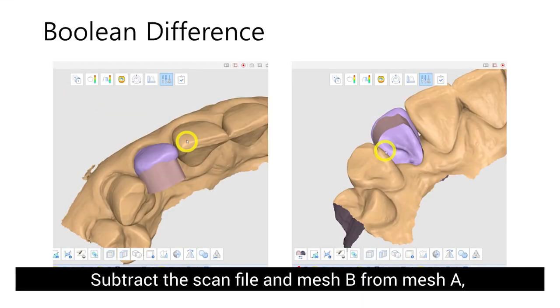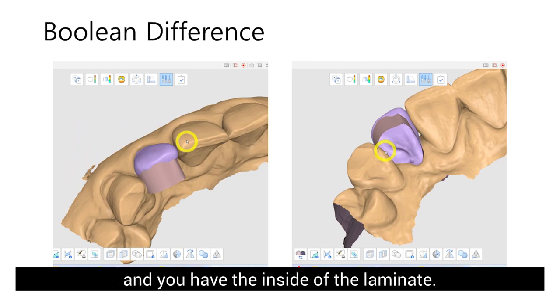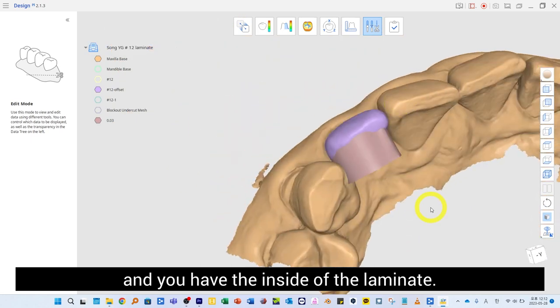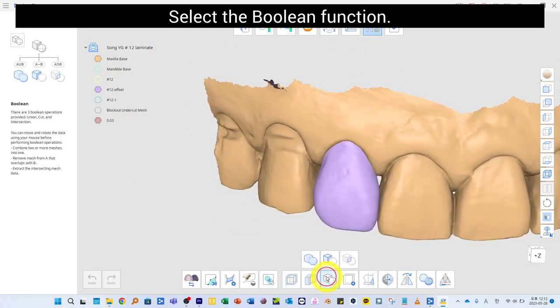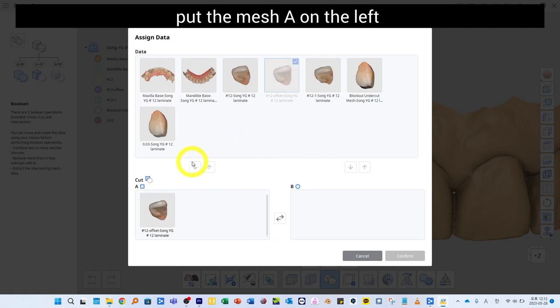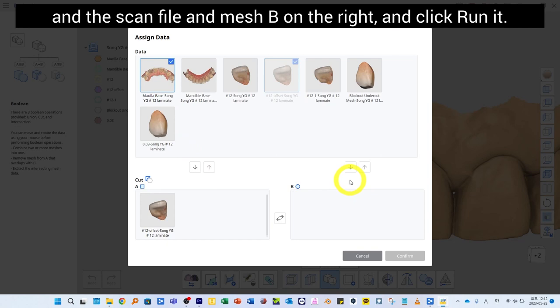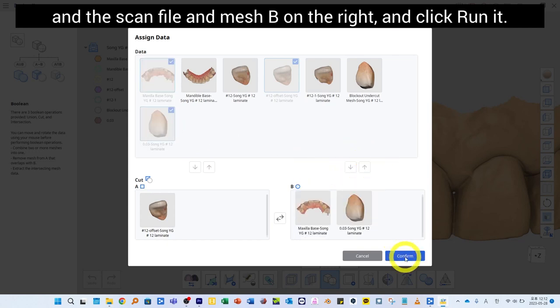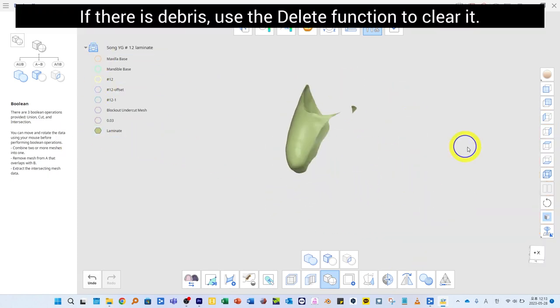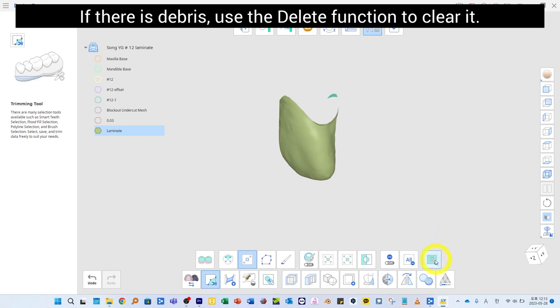Subtract the scan file and mesh B from mesh A to create the inside of the laminate. Select the Boolean function in Difference mode: put mesh A on the left and the scan file and mesh B on the right, then click Run. If there is any debris, use the Delete function to clear it.